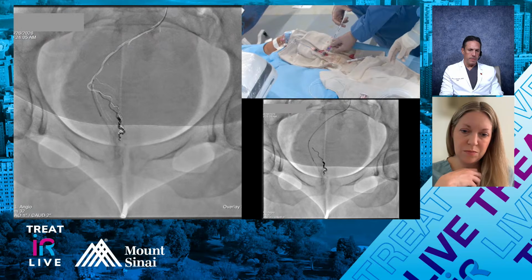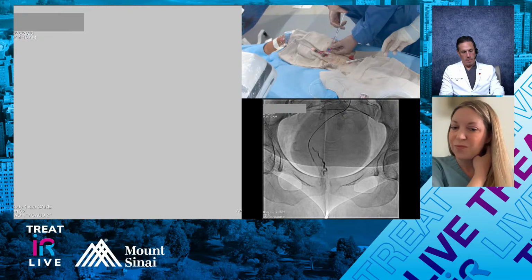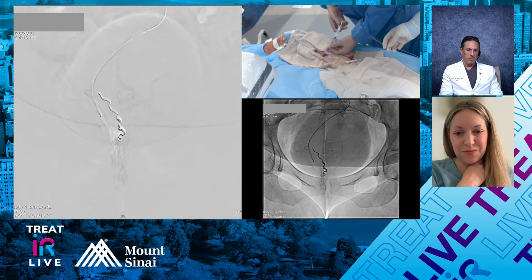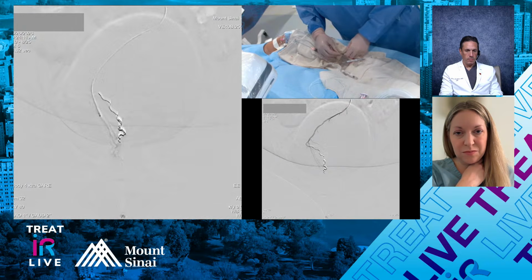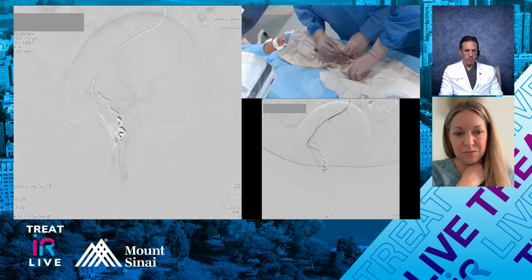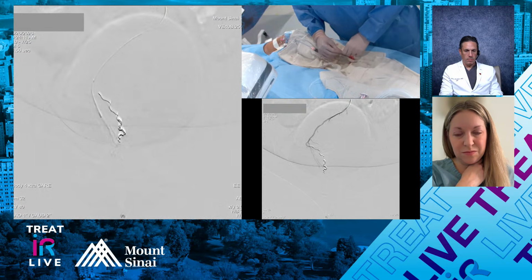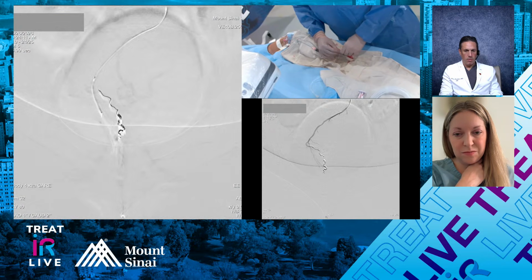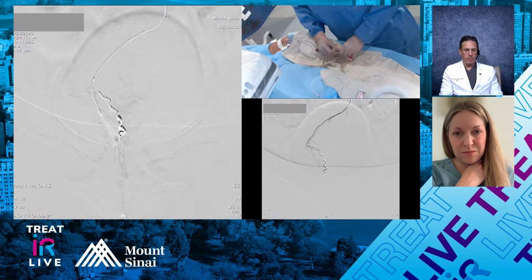We have this conversation, I think, about just about every procedure that we do. I think it's a matter of efficiency. I think it's a matter of getting the best embolization that we can. And I feel like with so many procedures, we've started in that place, and we've just kind of advanced to liquid. And I think hemorrhoid at some point in the future will be in that space. Whether that liquid exists now, I'm not sure. But I definitely think we're headed that way.